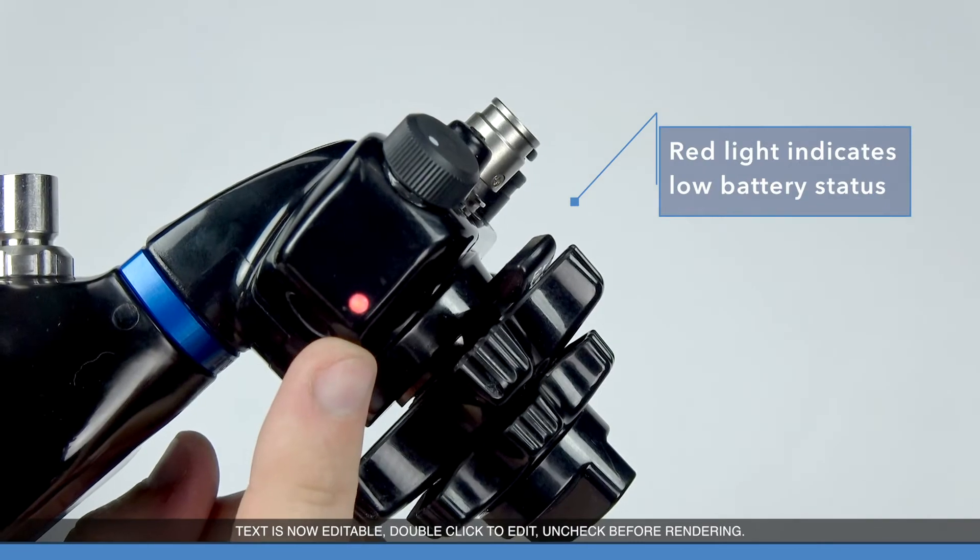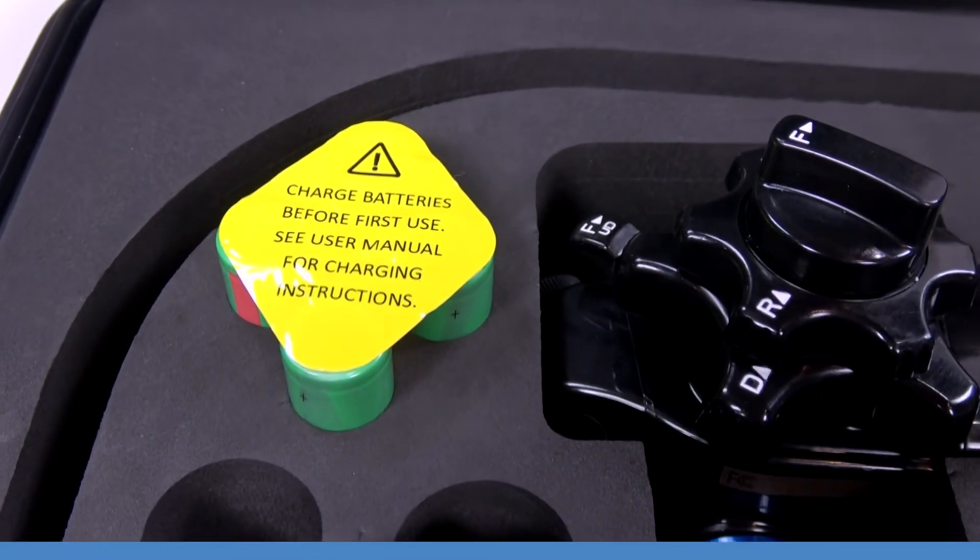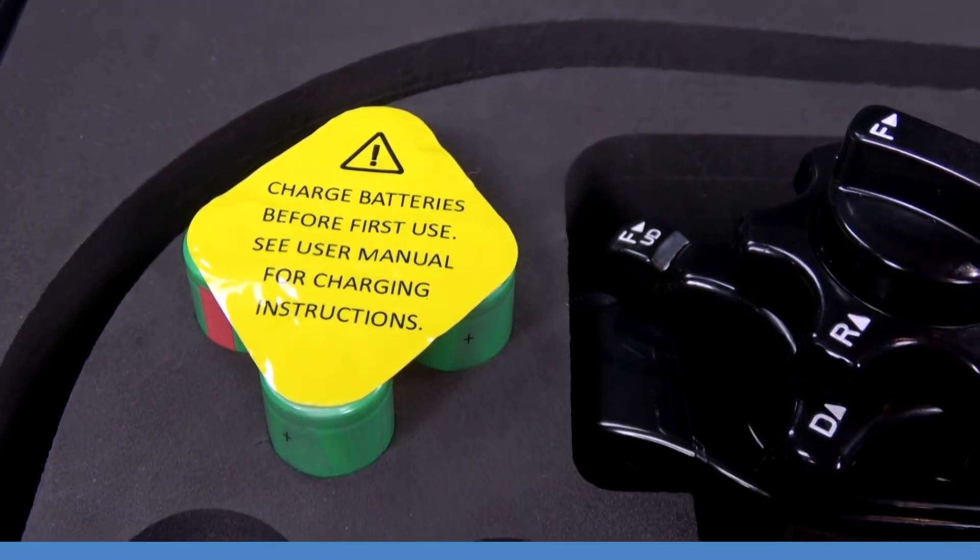Each scope features a three to four hour procedural use battery life, but remember you've always got an extra set in your carrying case.